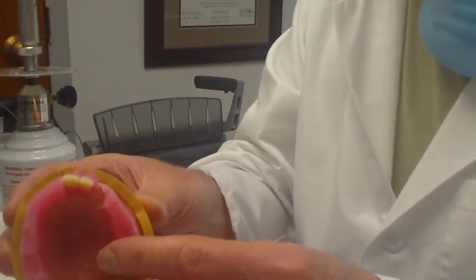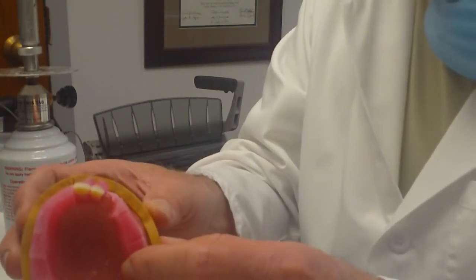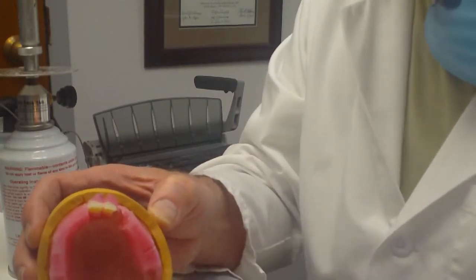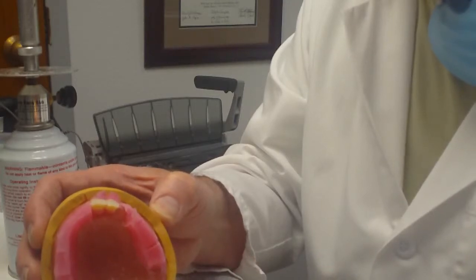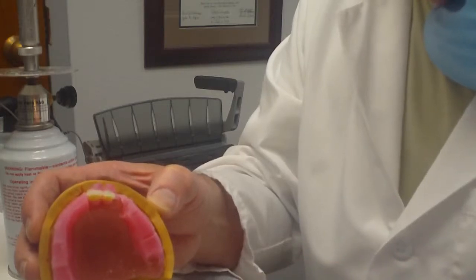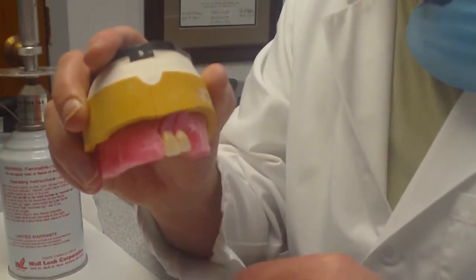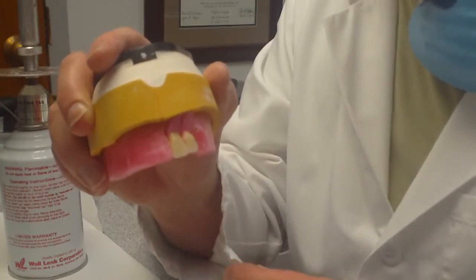So again, we're going to do the same thing. Again, you see we're following the arch form and have the tooth positioned relatively quickly, and we'll go ahead and get the canine. The position of the central incisor guides the entire setup. The position of the canine also will end up guiding the positioning of the posterior teeth. And one of the things that is important to remember is that when you're looking from the anterior view, as you're looking at someone's face, you're not able to see the distal of the canine. So it basically turns the corner.